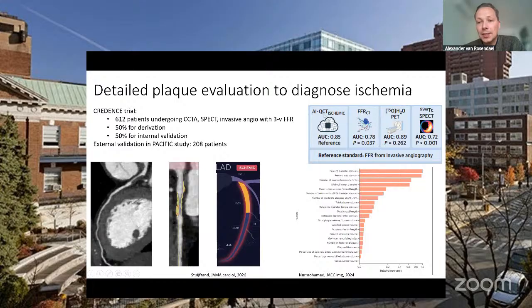And as you can see, this actually works very well compared with FFR-CT or PET imaging, and much better than SPECT imaging.